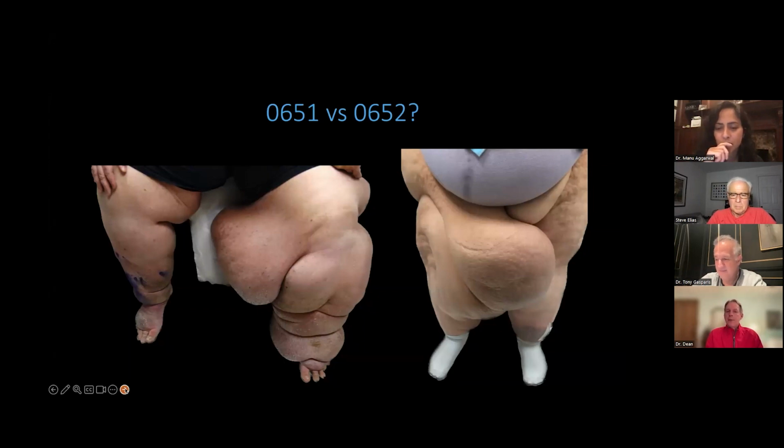No question about that. But apparently Tactile can still get a 651 device with extended sleeves. It can be done. It's not first line. It's going to be hard to get.